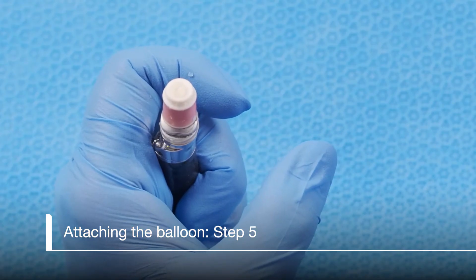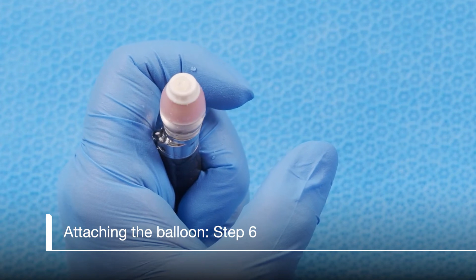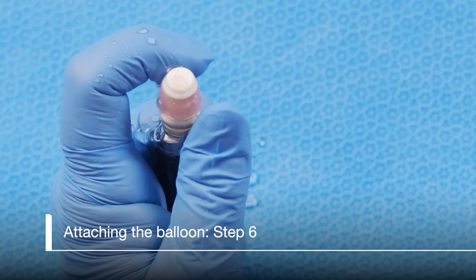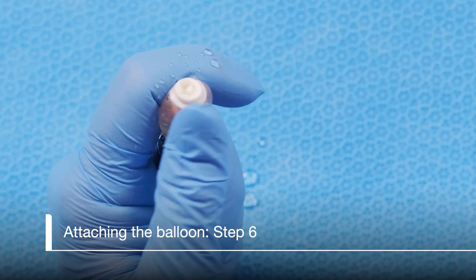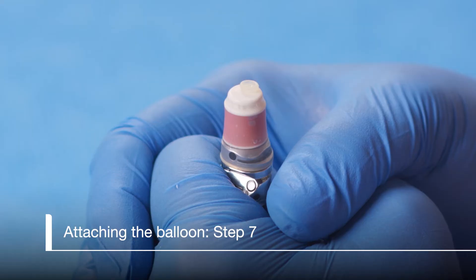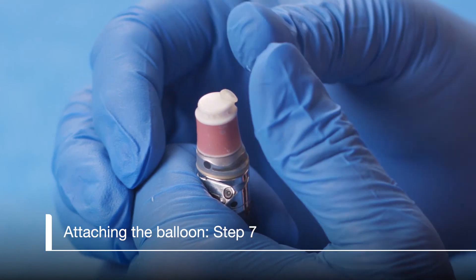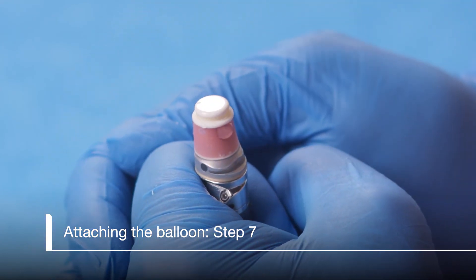Pointing the tip of the scope up, inflate the balloon with water. Gently squeeze the air bubbles out of the distal end of the balloon with your fingers. A good technique is to slightly twist as you are burping the balloon to dislodge the bubbles. Fit the distal ring of the balloon into the distal groove by starting the ring on one side of the groove and using both thumbs, roll it around to the other side.